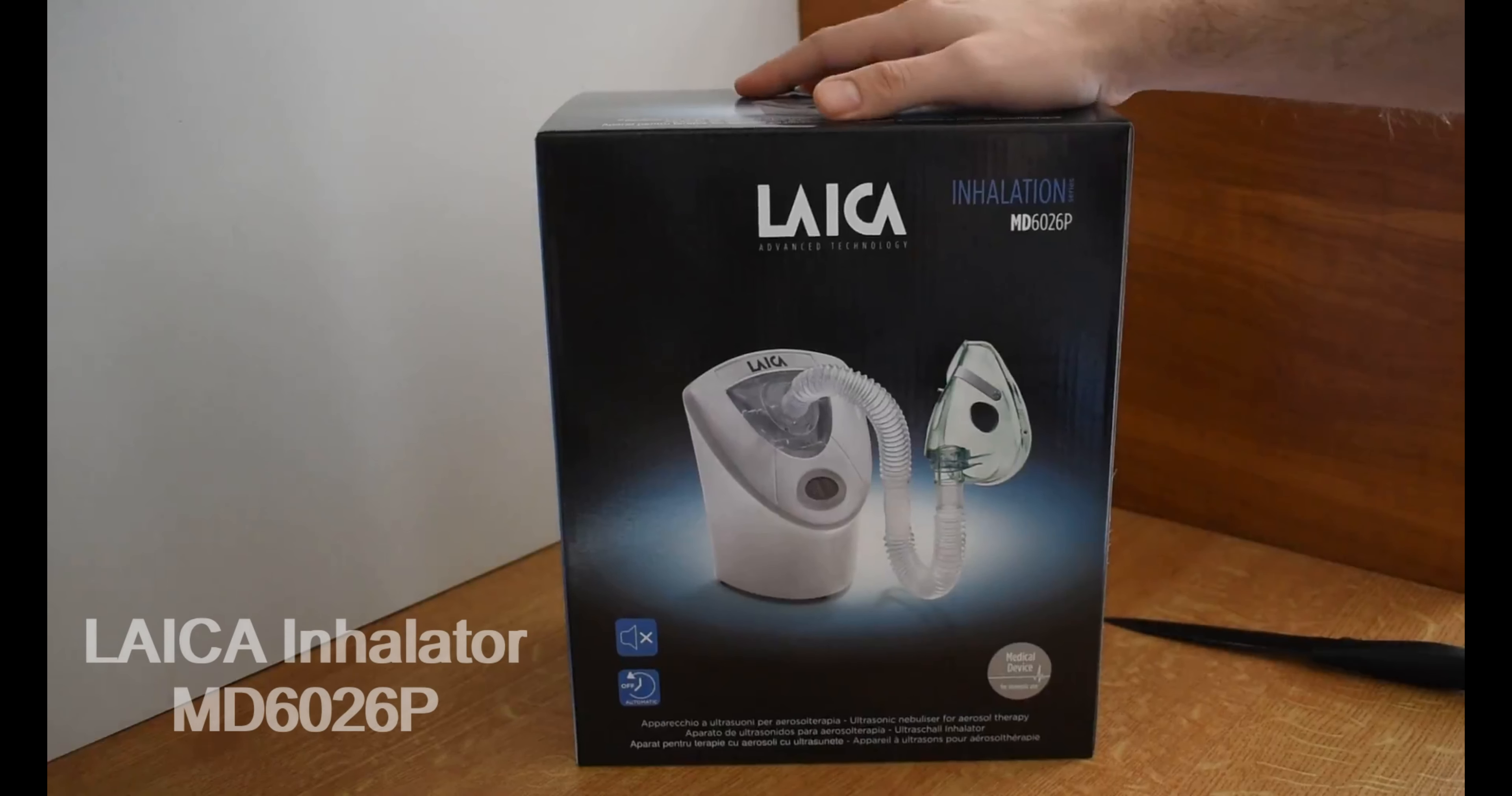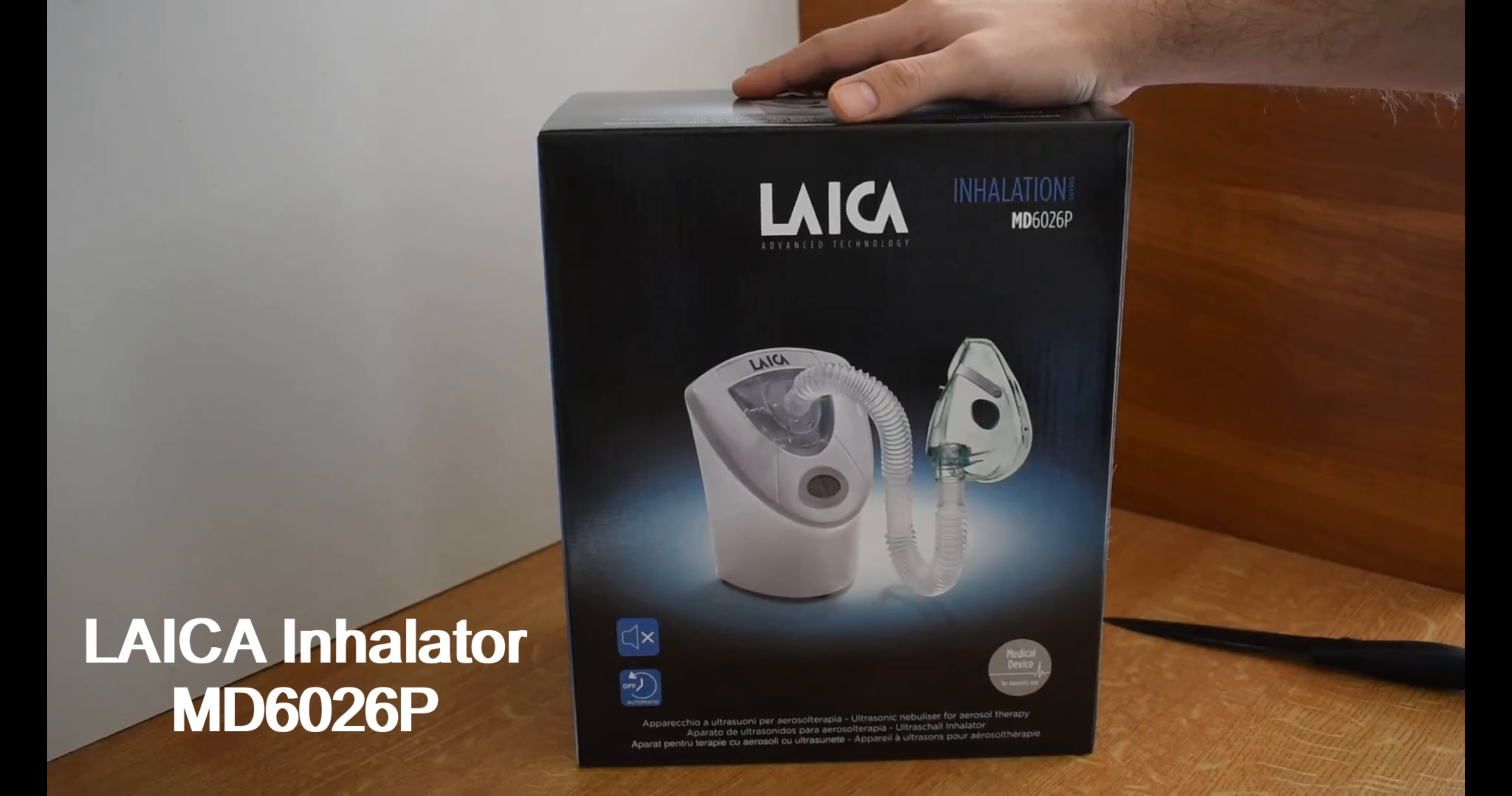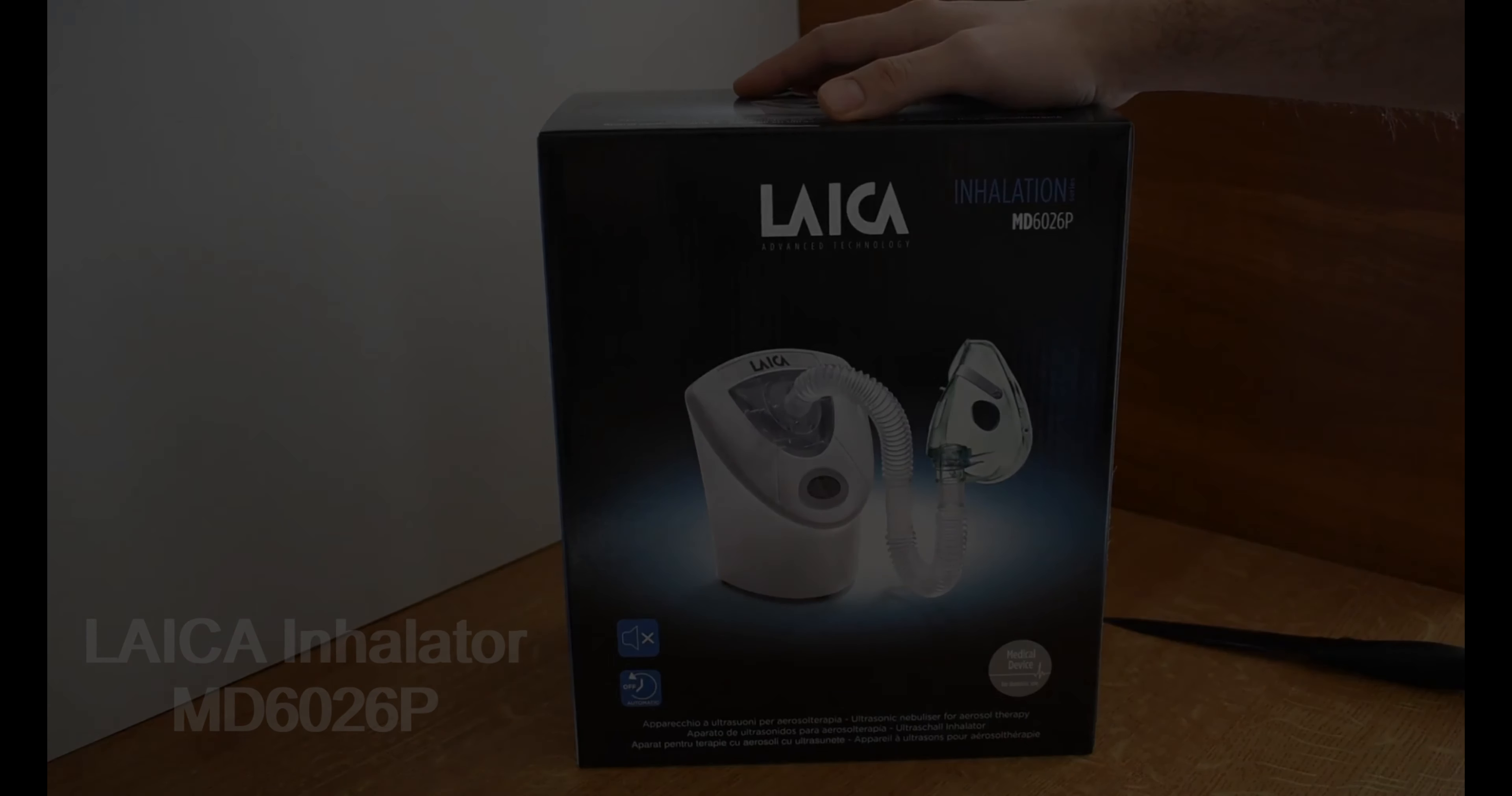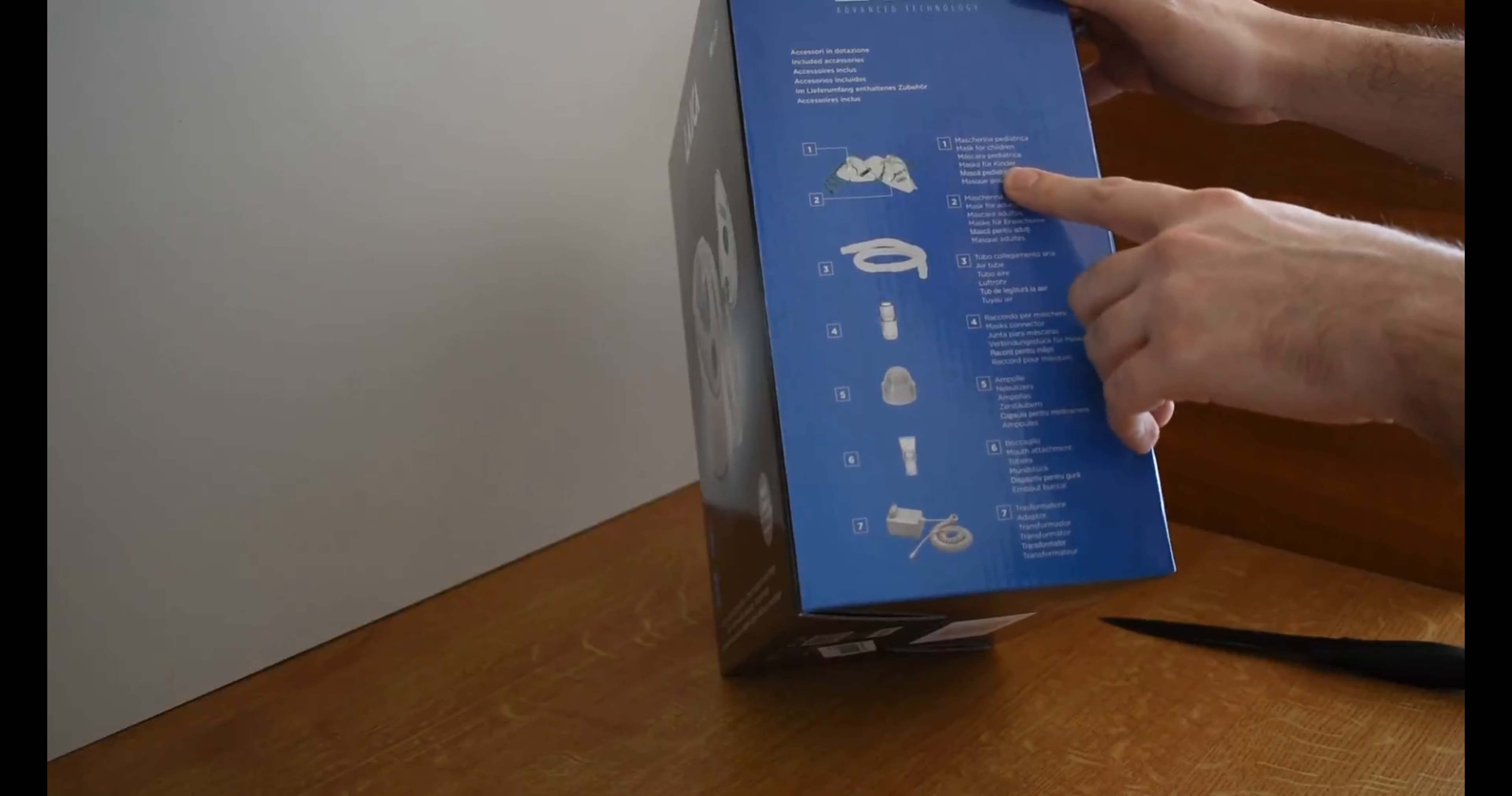Hi everyone, today we are going to review LAICA Inhalator MD6026P which we just received and can be used for kids and adults at the same time. Let's look at what we have on the box. These are the items included.